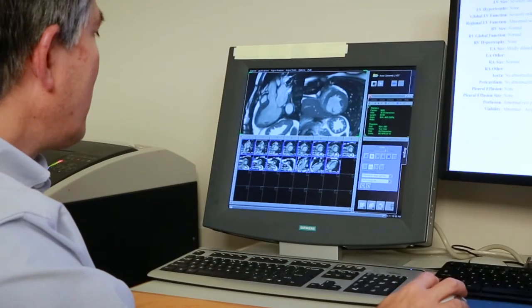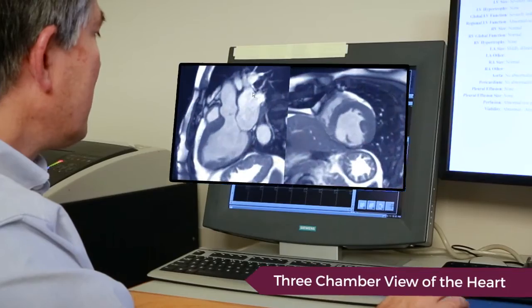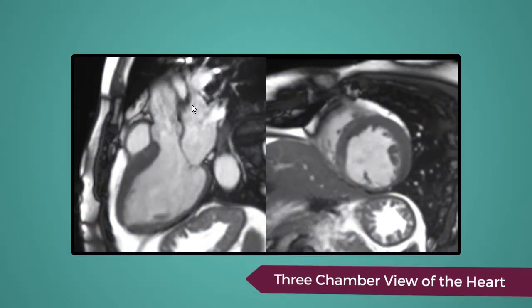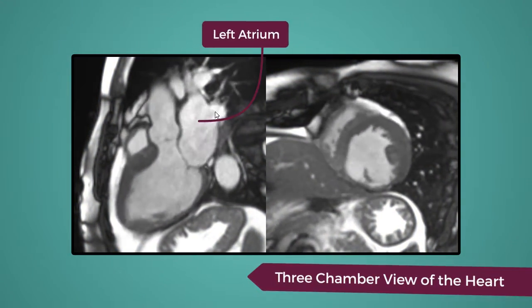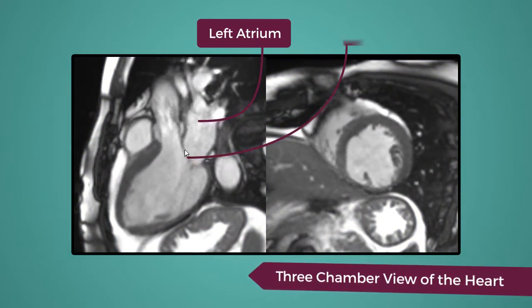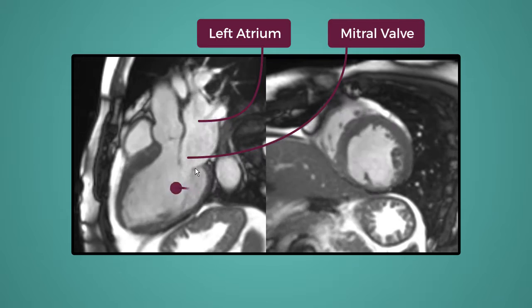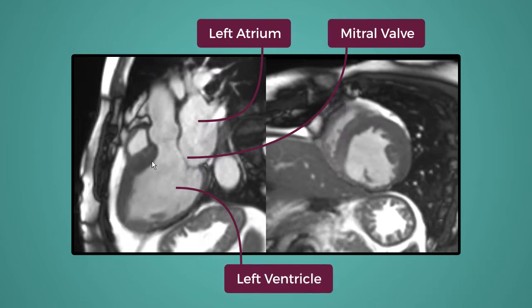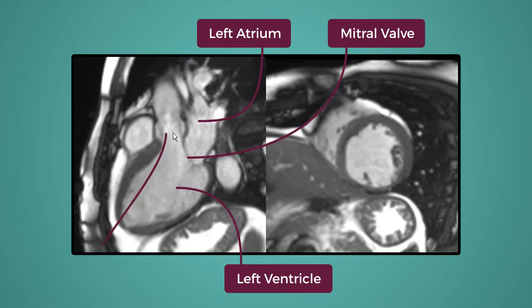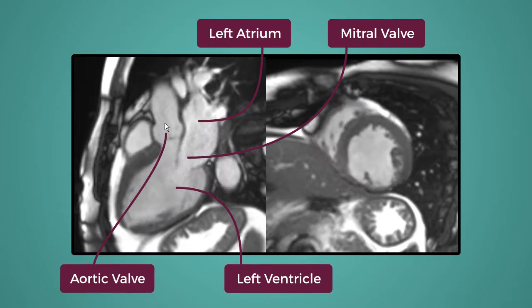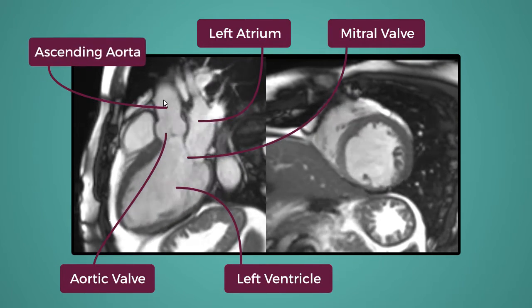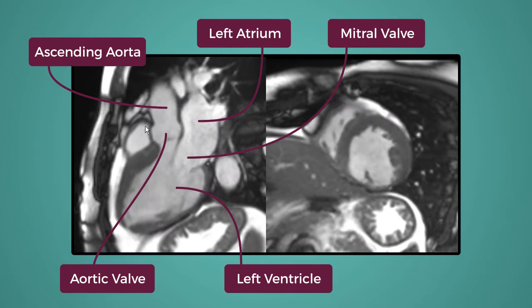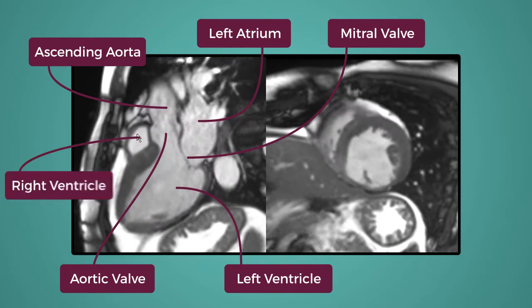The left-hand screen here shows what we call the three-chamber view. We see the left atrium, the mitral valve, the left ventricle, the aortic valve, and a little bit of the ascending aorta, and a little bit of the right ventricle.